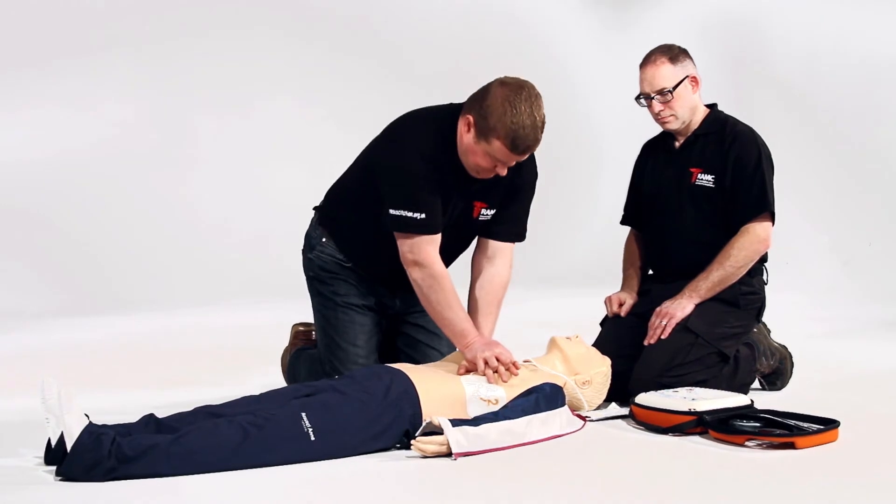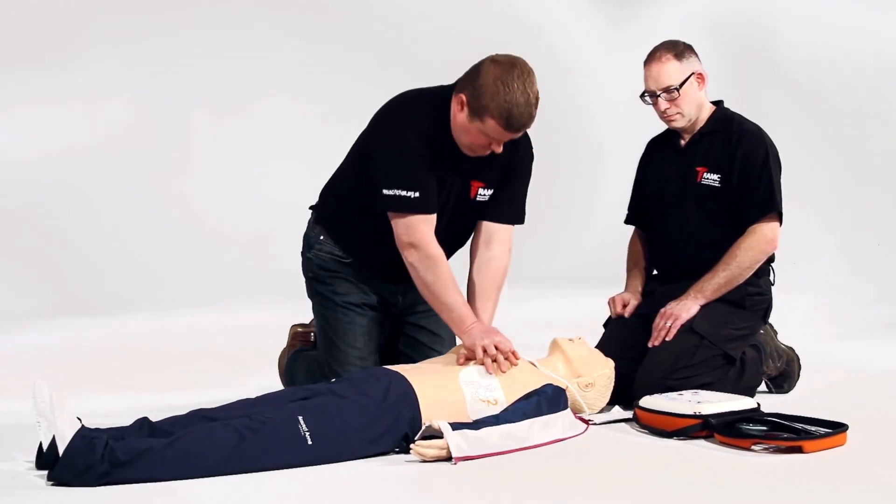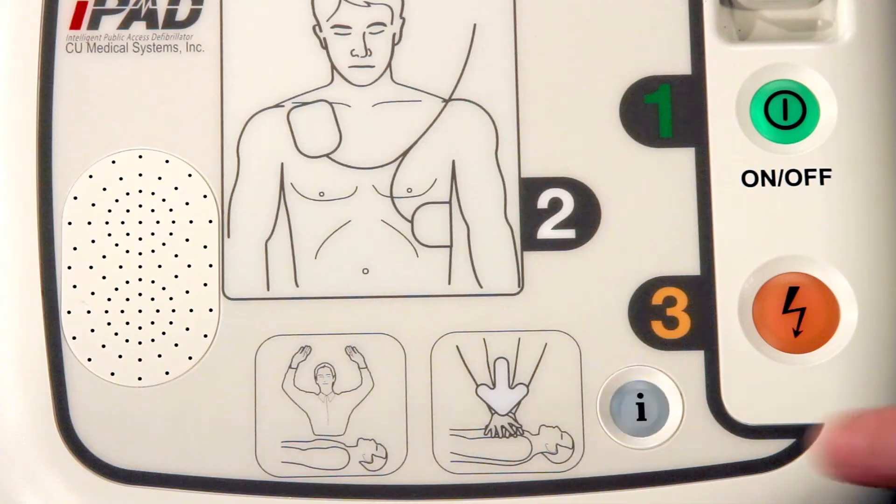Begin CPR now. Press the flashing blue I button for CPR voice prompt.